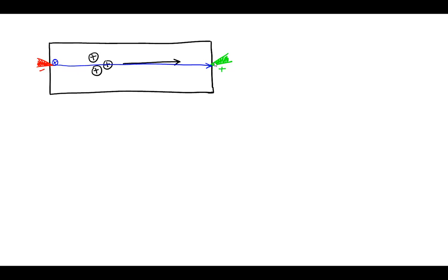And if that charge were to move in that exact path, the electrodes would get very excited and report a reading, and that reading is in the form of a voltage, and the voltage would be very high. Now this blue arrow, because it has a distance and a direction, is called a vector. And in physics we learned that a vector is just some kind of distance with a directionality to it.